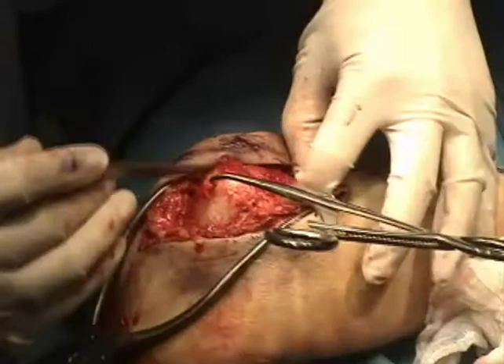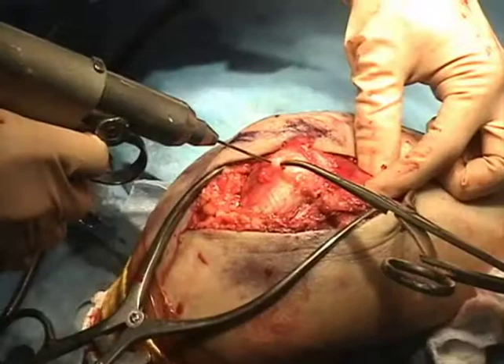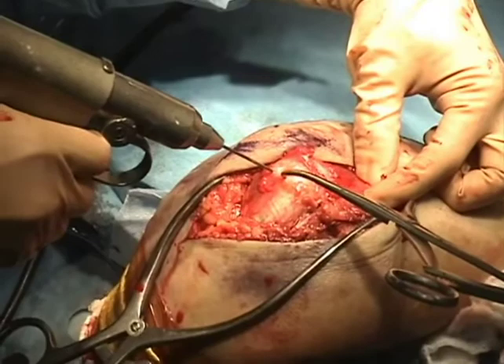This then allows the elbow to be flexed, which makes it easier to pass the longitudinal intramedullary Kirschner wires, which are between 1.6 and 2.0 millimeters in diameter.